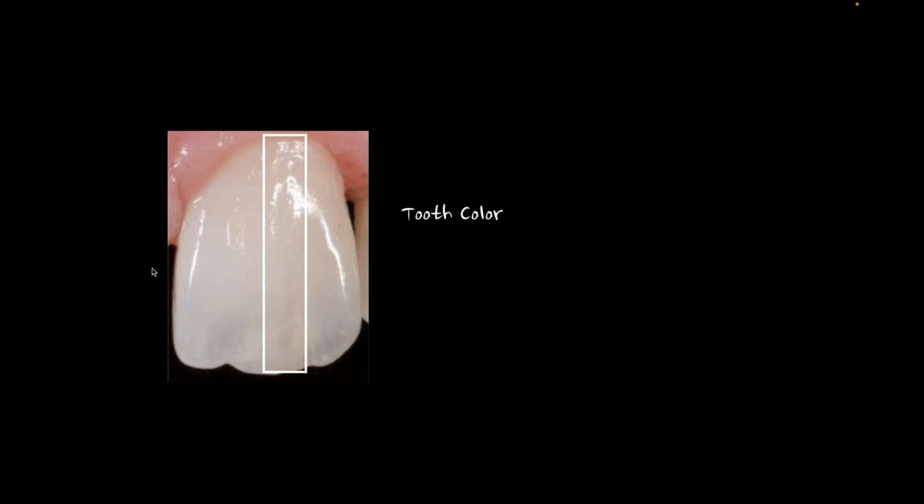Where we lose some of the aesthetics is in two major areas. One is the embrasure spaces that we're not creating like nature has provided for us. And two, in the amount of translucency. Translucency is not the last millimeter of the incisal edge. Sometimes, if you look at the distal translucency here, it's almost halfway up the tooth that I really need to be working that translucency in and bringing that translucency all the way up. Look at how translucent I am right here in the center of the tooth, right? It's not just that incisal edge position.